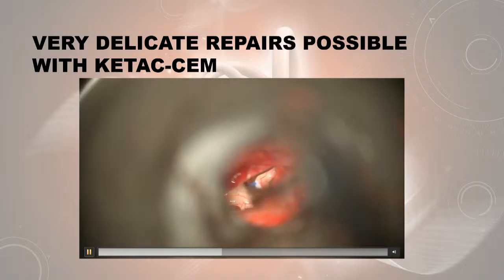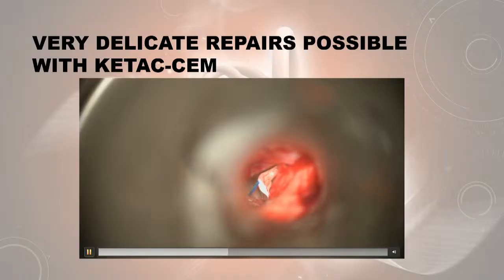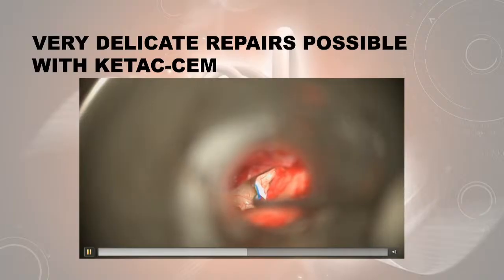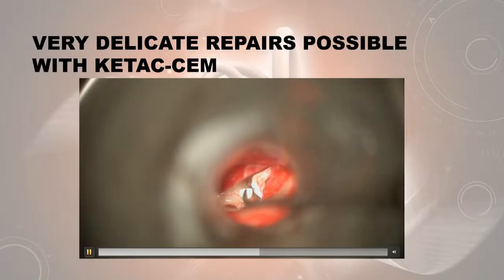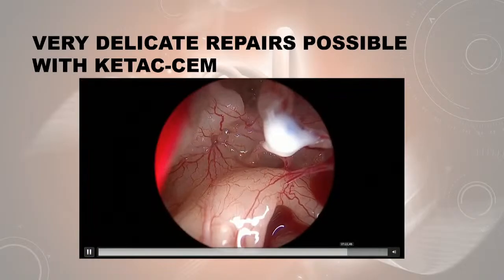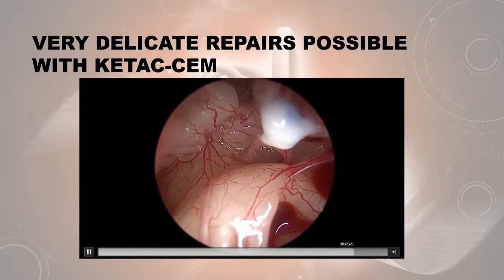I almost never use cement without a nylon core. So we just put a little nylon core. It actually stuck, and I just used a bit of its properties to swing it into the right place. Just a small piece, just to cross the defect. Again, what it does is it tends to bind the cement a little bit better, and then we end up with a result looking something like that.